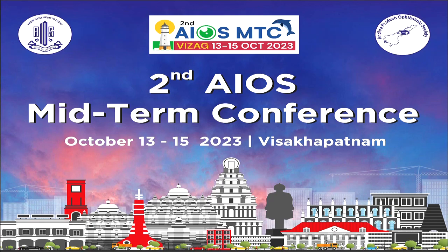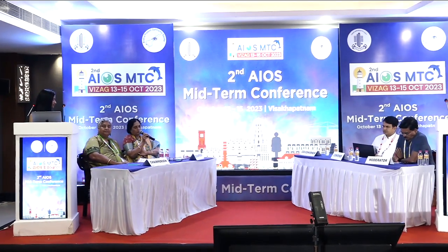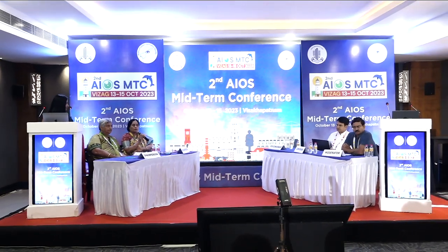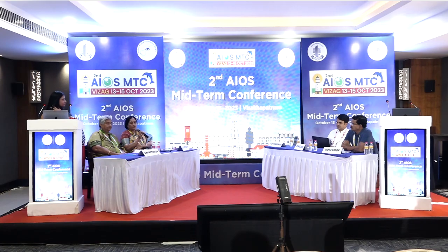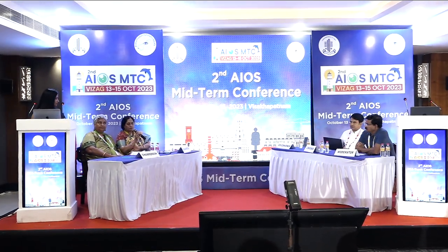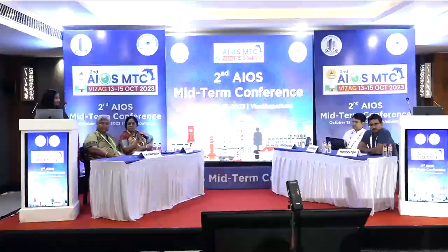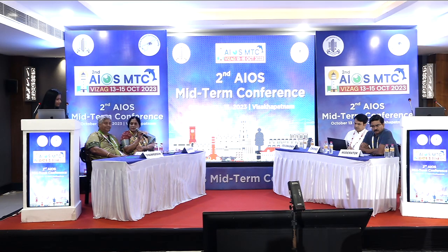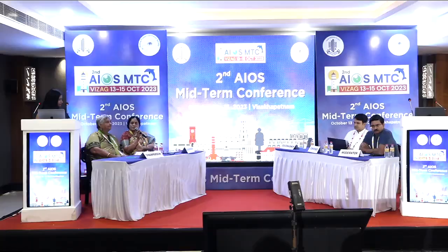That was a good insight into the MRI and its importance. What I find is that quite often few radiologists are very attuned to orbital anatomy and orbital lesions. Quite a few of them in their training course don't have too much of orbits dealt with. I make it a point and tell my residents to make a point not to look at the report first. Try to clinically correlate, try to understand what is the T1, what is the diffusion, come to a conclusion, go back, look at the report, and then, like you said, correlate with the radiologist.